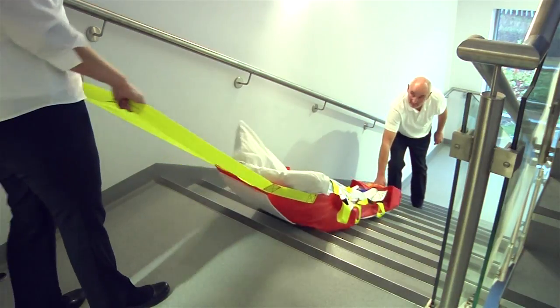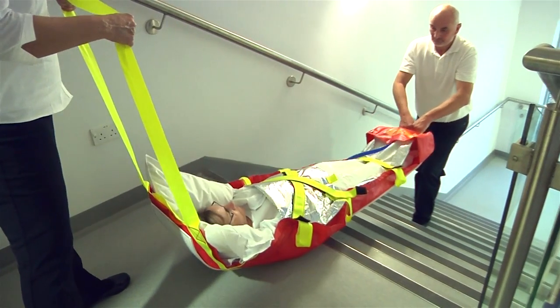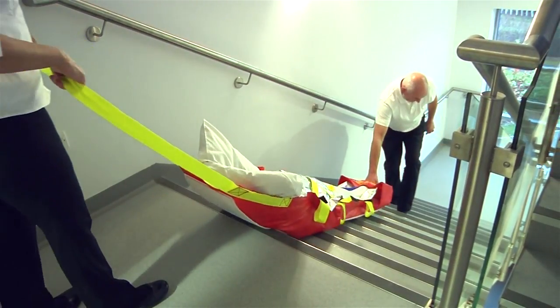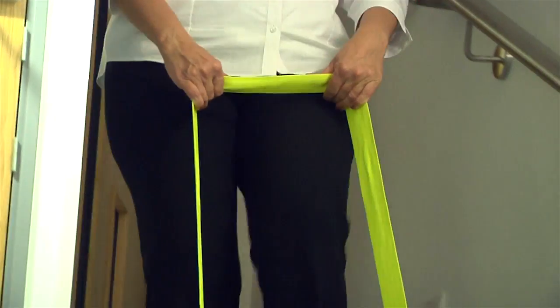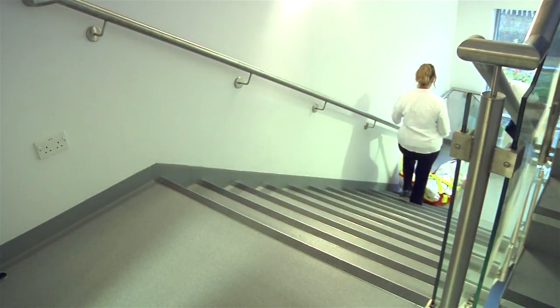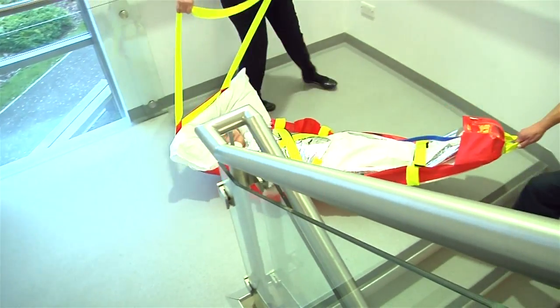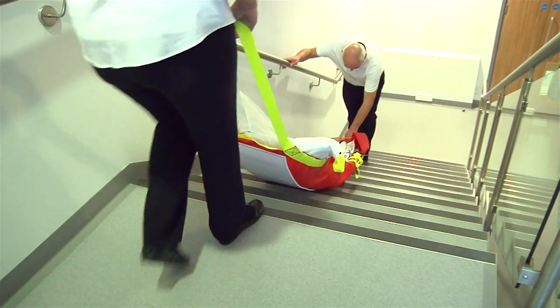Once the weight ratio changes, let the foot end come into contact with the stairs. The operator at the head end should keep the pulling strap long and assist by slightly raising the handle as the body moves over the top step. The speed of descent is controlled by the operator at the head end. When reaching the half landing, it is important to steer a wide course so you do not encounter problems with the central pillar of the staircase.